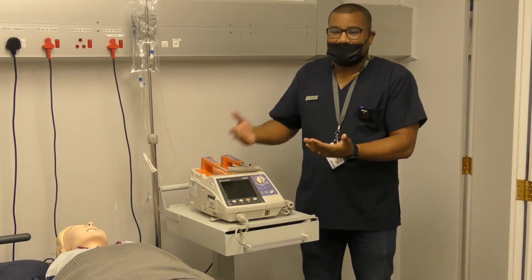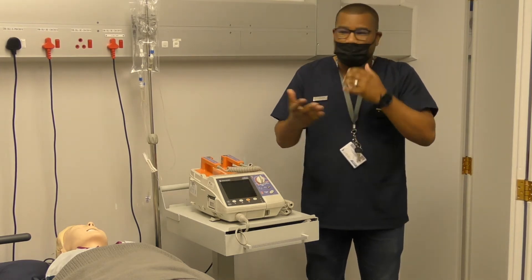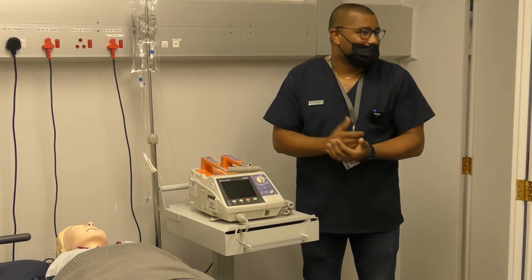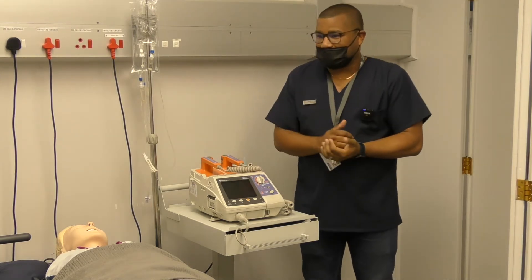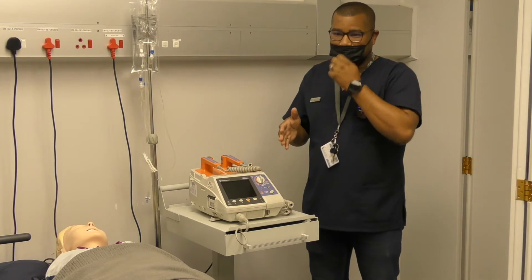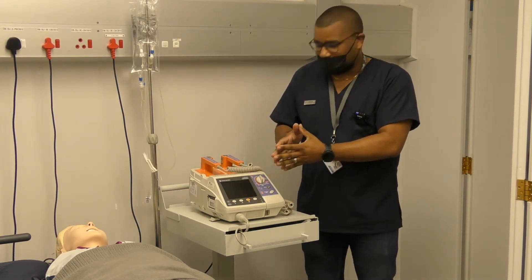It's important for you to familiarize yourself with the equipment, as each device comes with a user manual. That user manual will contain a lot of important information — how to operate the machine normally, how to store it, and what the default settings are. Those are important things for you to know when you are faced with a real-life situation where you have to use it.